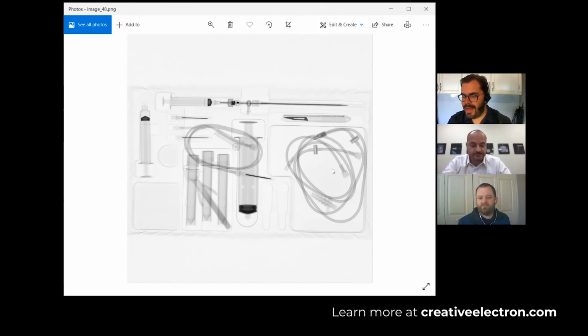Overlapping them. Yeah. So this is where that line Bill was describing gives the system the flexibility to be matched with different configurations or different types of use. You have one on top of each other, you're still going to find it. So in this application, X-ray becomes a very, very powerful tool.